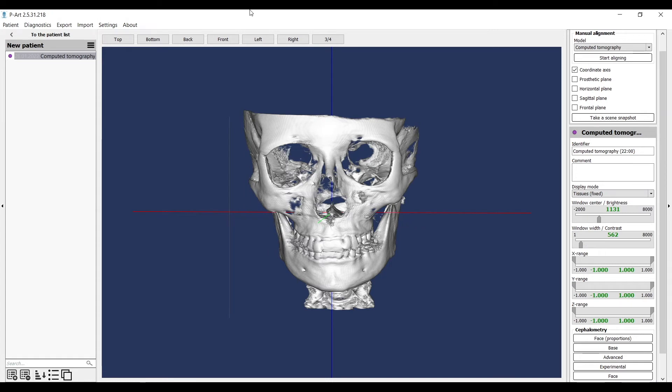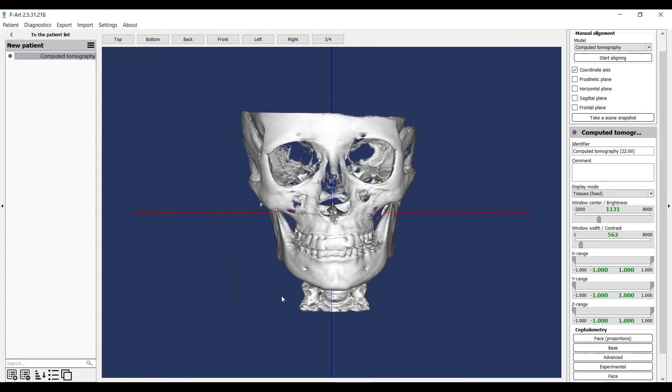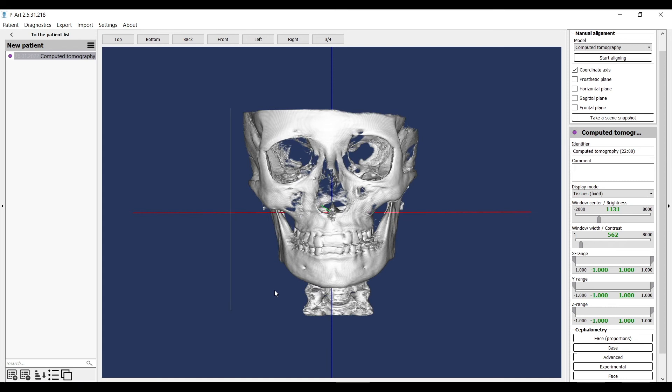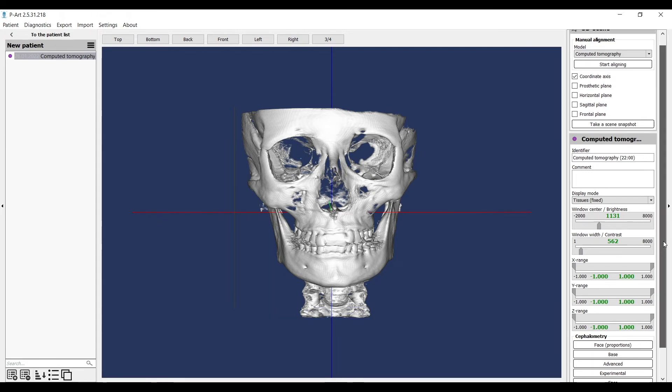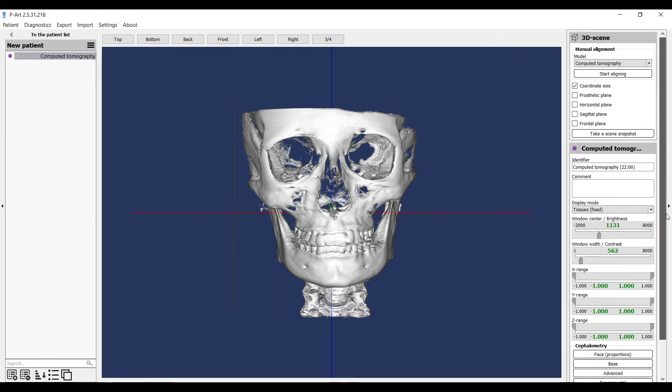Before you combine tomography with complex diagnostics, you should check its alignment. If you see that the tomography is shifted or has a slope, you need to align it.